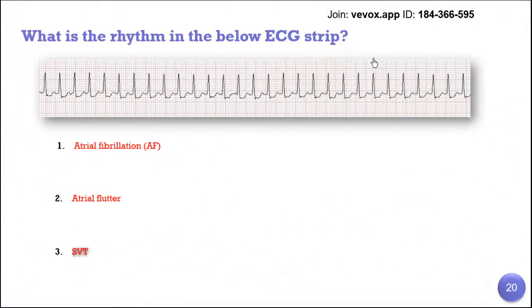So let's take this one. Again, kind guy. Is it sawtooth? Please don't choose two. Please, I beg you. The one who is in love with atrial fibrillation, stop your love today with atrial fibrillation, atrial flutter, I'm sorry. Why not ventricular? Because it's narrow, it's not wide. As long as you see a wide QRS, it's something coming from the ventricle. So no ventricular here, okay?